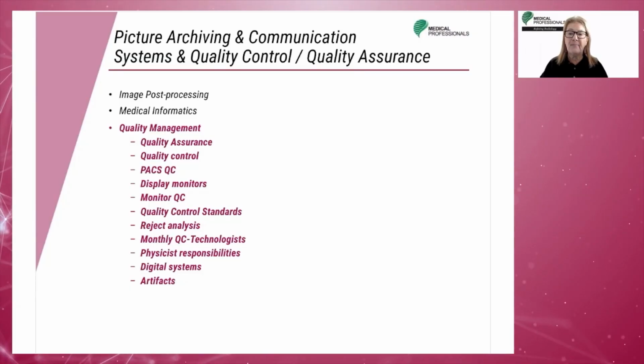Procedures in the PACS environment. Quality management in the radiology department assesses all aspects of the department that have an impact on patient care and the level of quality of that care. Quality management of concern to staff technologists is divided into two broad categories: quality assurance and quality control.